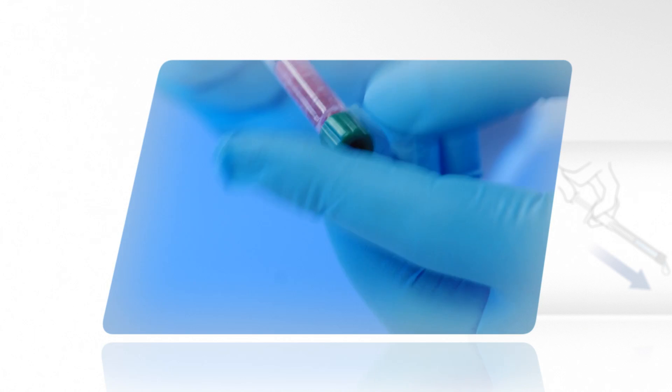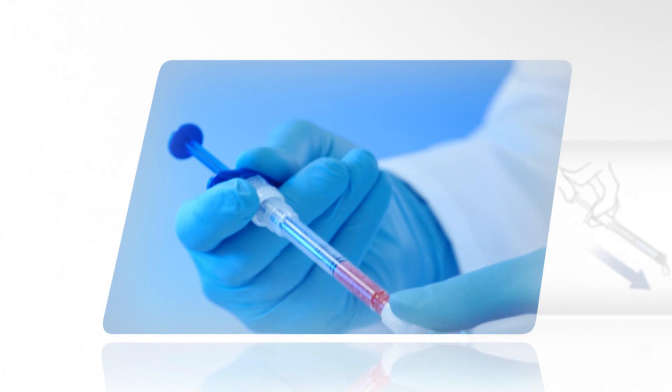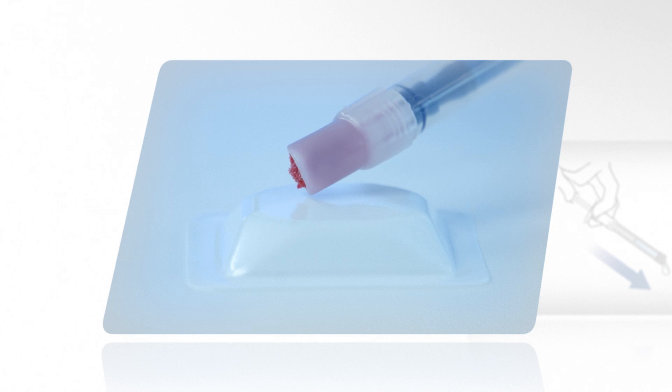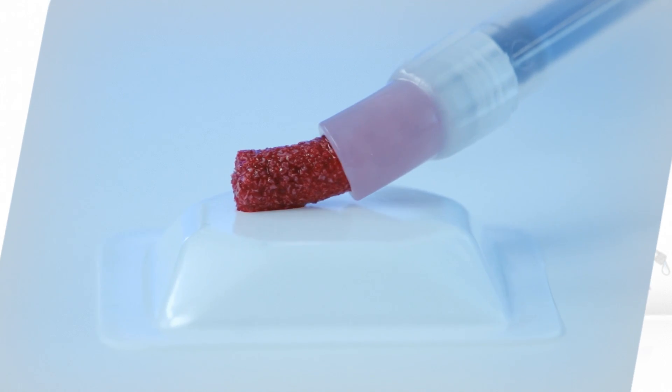Replace the filter cap with the curved applicator tip, and the Geistlich Bio-Oss Pen is ready to use.